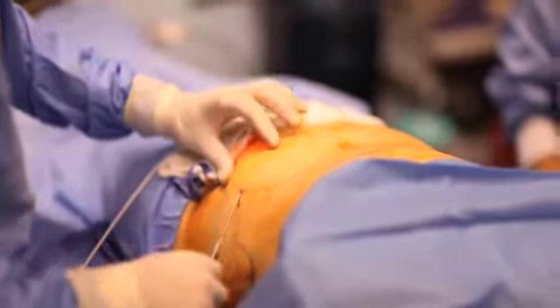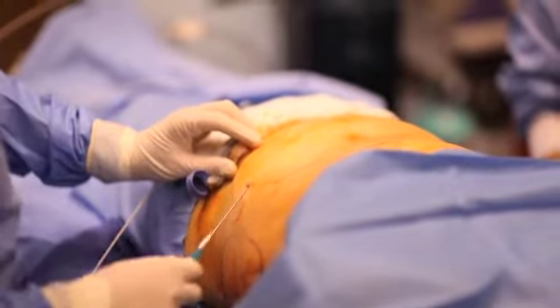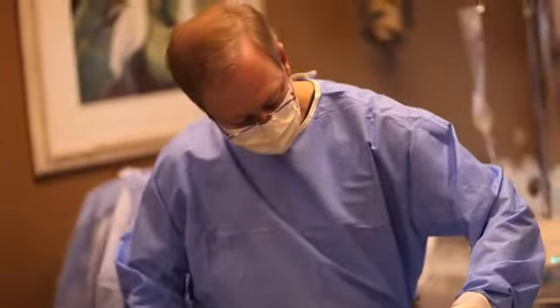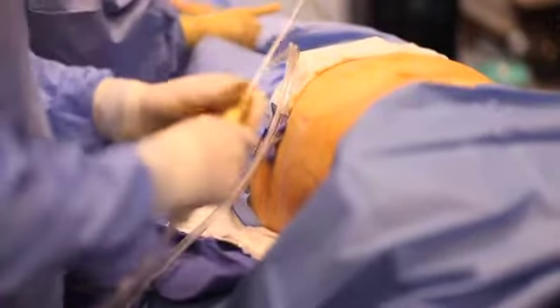BodyJet is designed to loosen the fat in the targeted area without essentially destroying the individual fat cells in the way traditional liposuction works. BodyJet allows for a less swollen mass in the area, less trauma to tissue and skin, and an overall more comfortable procedure for the patient.